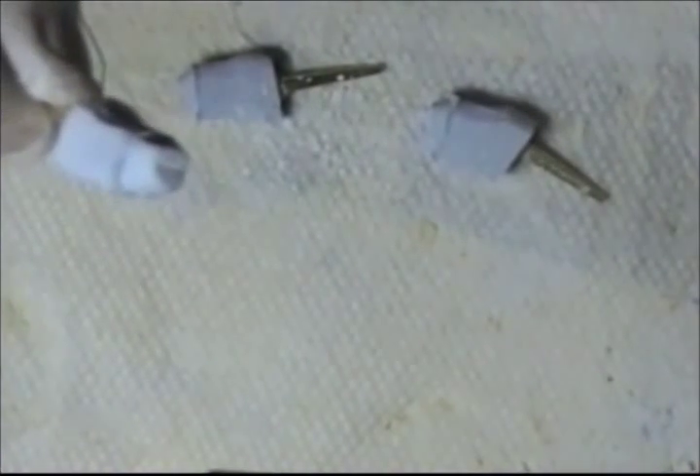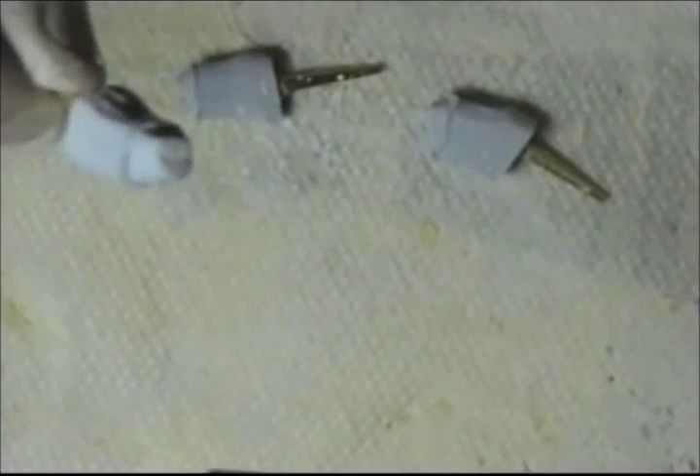My burr is a little dull, so I am going to put a new burr in and continue the demonstration.